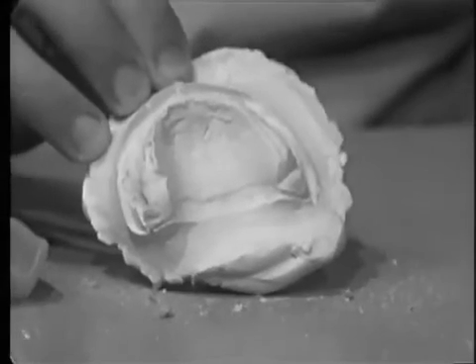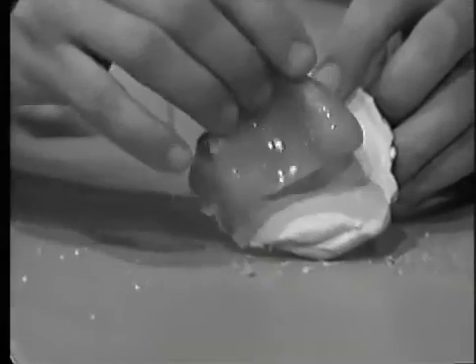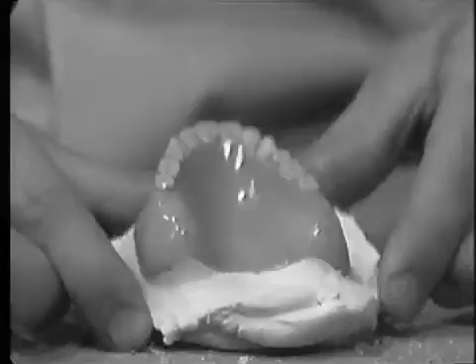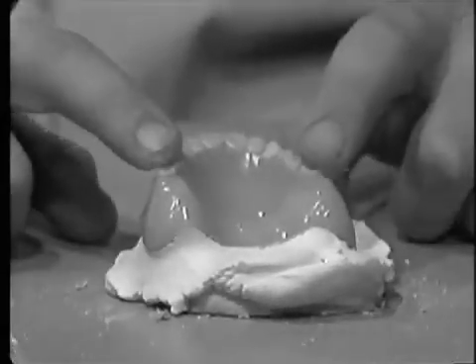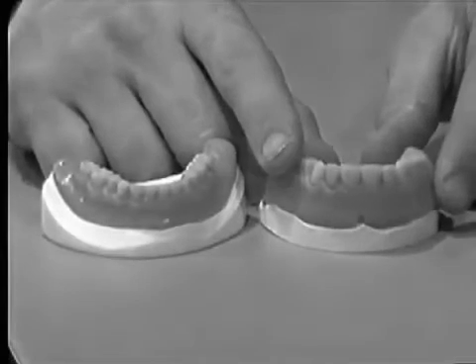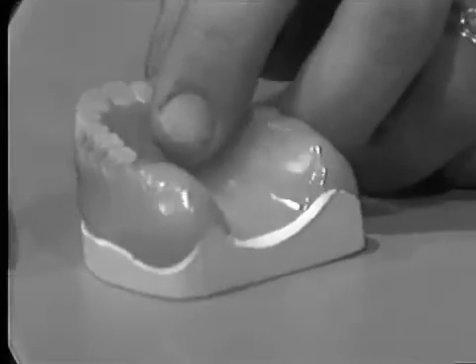After both the cast and the denture have been cleaned, we place the denture back onto the remount cast and test for stability. This is done by placing a finger on each side of the arch and attempting to rock the denture from side to side. The denture is then placed back onto the remount cast and the cast itself is trimmed.